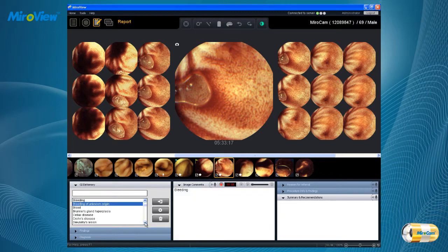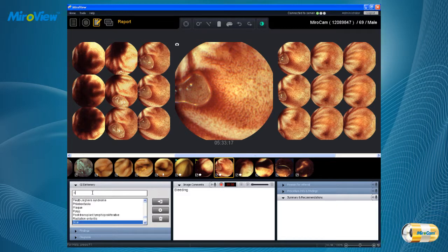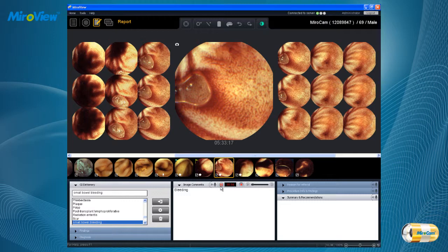After reviewing the patient file, click on the report mode. The GI Dictionary provides the pathologies that are frequently found within the small bowel. Choose the available disease pathology correlating to the image. If it is not listed, a user may add his or her own pathology. The image comments box will allow users to write their comments for the captured image and to record voice comments for a minimum of 3 seconds to 5 minutes.